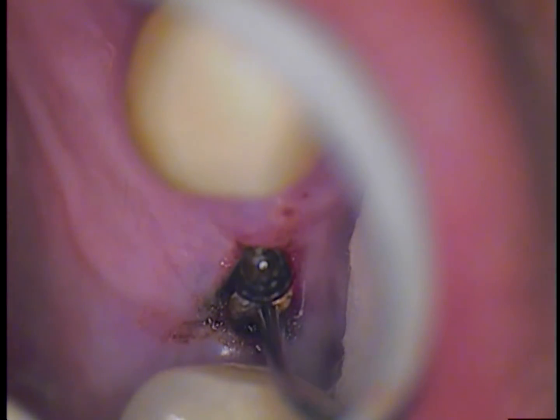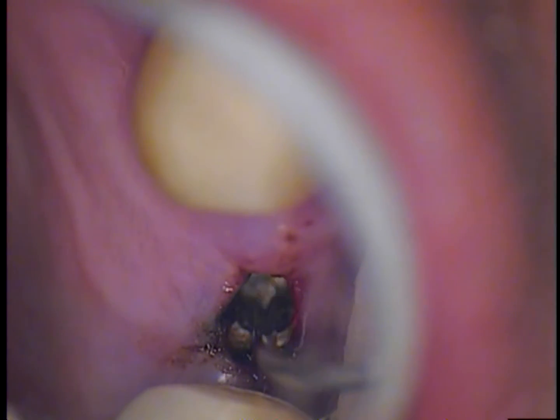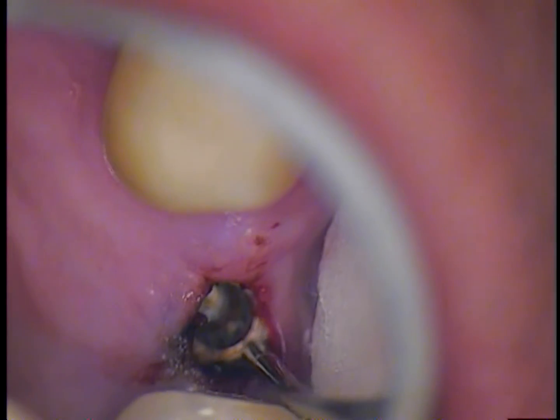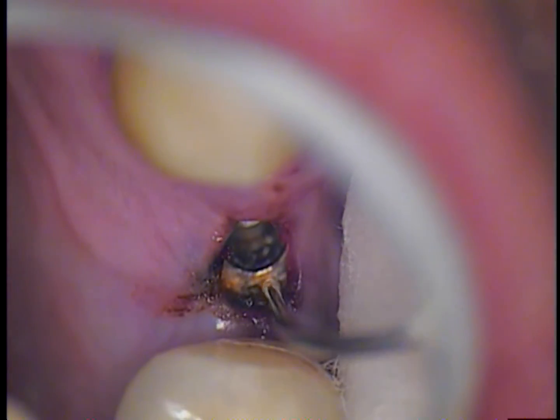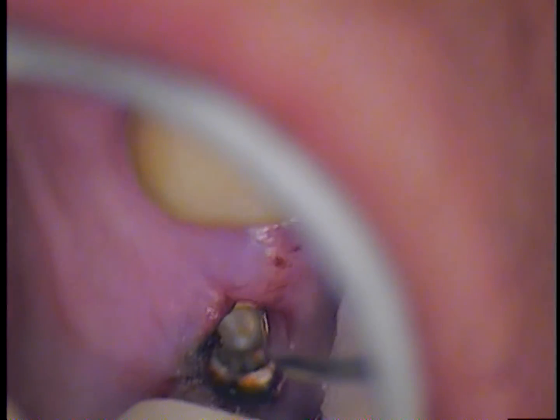We have just pre-soaked for at least 20 minutes with tartar and stain remover. We are now going in with a 20-gauge suction. It is a blunt-end suction, so there is nothing sharp on the tip. We are perusing the area and hopefully we are going to have a loose screw here soon, so I am going to go in and test it.